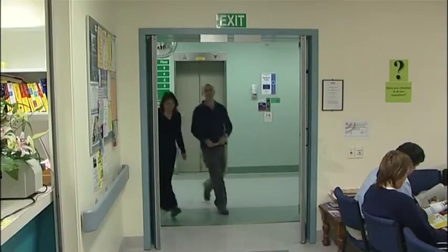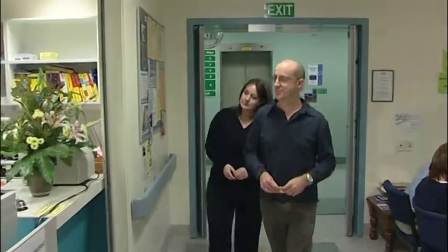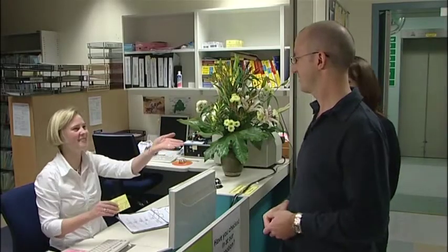This is needed in addition to any diagnostic CT scans you may have already had. For your first visit, you will check in at the radiation therapy reception desk. You're always welcome to have a support person accompanying you to your appointments. Take a seat with the nurses, thank you.